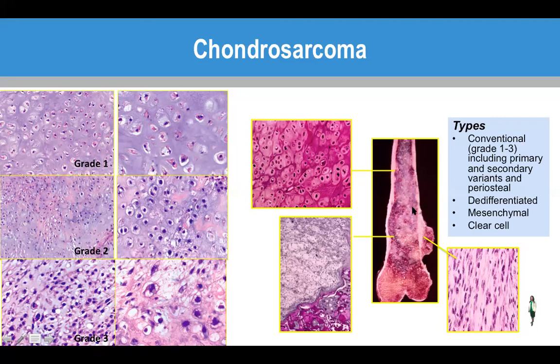First, we know this is malignant because the tumor replaced the medullary space, broke the bone, and went into the soft tissue. The reason we know this is chondrosarcoma is because it's producing cartilage. So radiologists and surgeons will study this, and they already know this is chondrosarcoma.